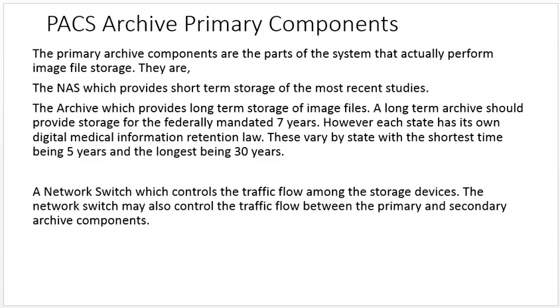So depending on which state you find yourself in, or which state your archive is in, depending on if your archive is in the cloud or some other place, how long you have to keep the images will be based on the legal requirements. Here's a good idea: just keep everything forever. Storage is cheap. There's really no need to spend a lot of time trying to delete images out of your database. I prefer to just store everything forever. It's easier that way. The third primary component is a network switch, which controls the traffic flow among the storage devices. The network switch may also control the traffic flow between the primary and secondary archive components.